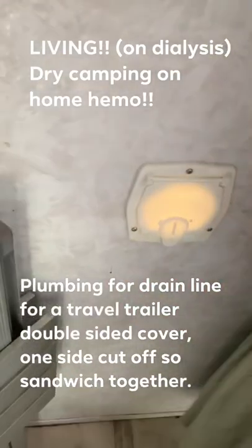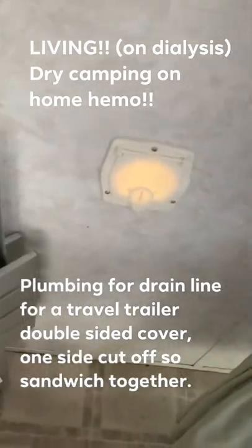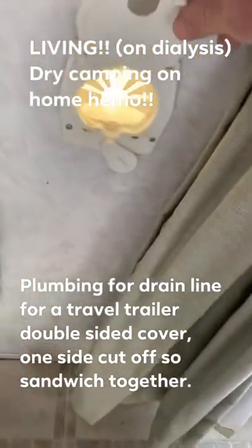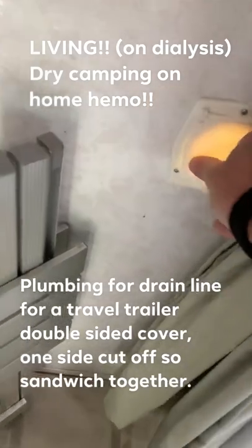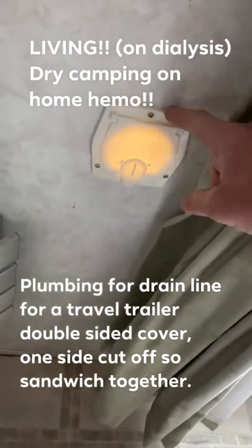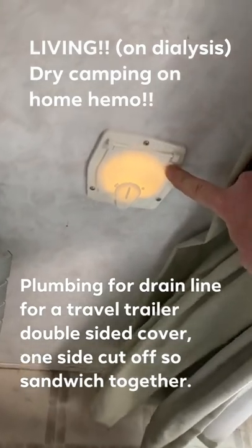A lot of people have asked me how I have plumbed my PD and home hemo tube. As you can see, I have a door, and what's weird is they make a ton of these to be mounted on the outside but not the inside. So what I had to do is grab two of them and cut off the backside so that it would fit on this side. I'll show you the back side to explain what I mean.